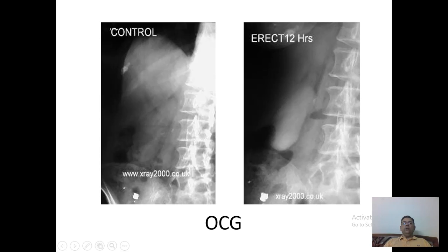6 tablets were given, and then another film was taken, और उसके बाद पेशेंट को एक फैटी मील देते थे. आमतौर पे हलवा पूरी मंगाई जाती थी, मरीज़ एक पूरी खाता था, बाकी सारे डॉक्टर मिलके खाते थे हलवा पूरी, और फिर उसके बाद दोबारा 1 घंटे के बाद ये देखने के लिए कि गॉल ब्लैडर फंक्शन कर रहा है कि नहीं, कॉन्ट्रैक्ट किया है कि नहीं, फिर एक दोबारा फिल्म ली जाती थी. Now this investigation is no more required, it is not done, it is just to give you some historical perspective, या कोई मेरे जैसा जो है वो आपसे पूछ भी सकता है.